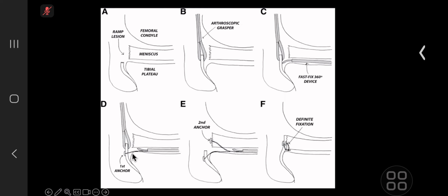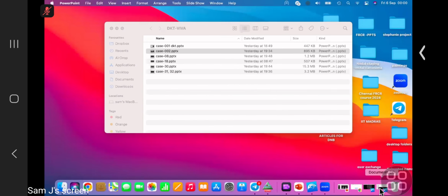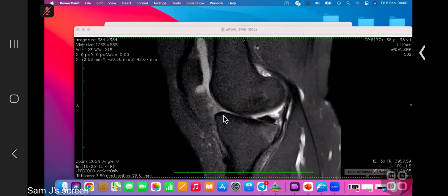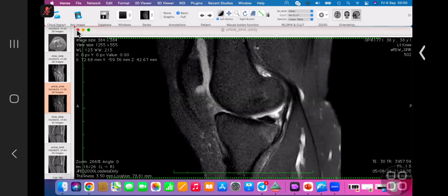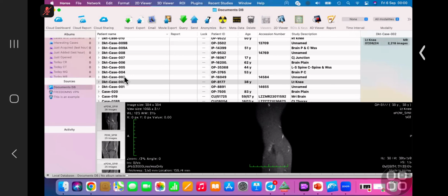Okay, let me show you another case. Okay, case 3.